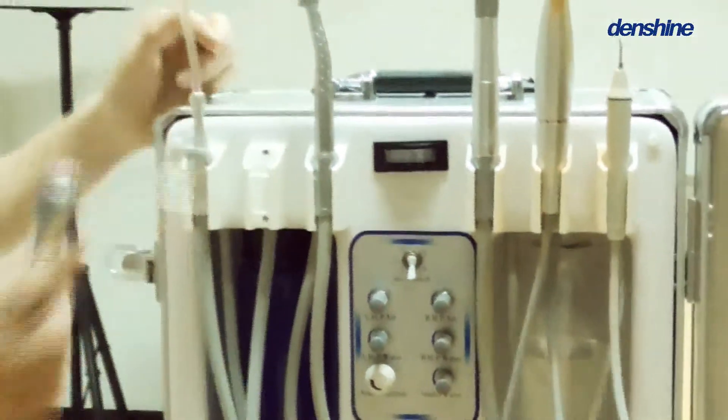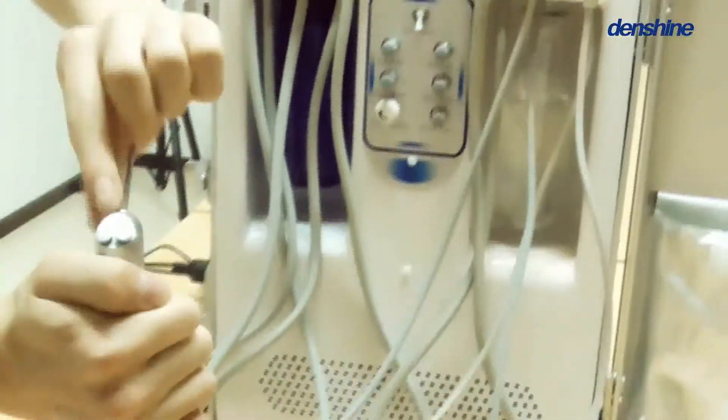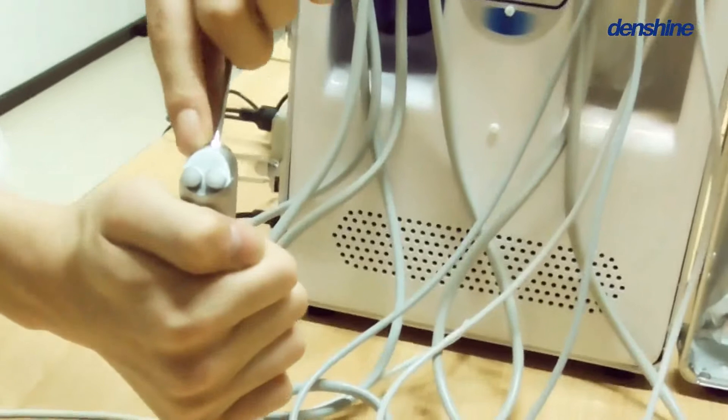Secondly, the triple syringe, which is capable of both water and air functions.